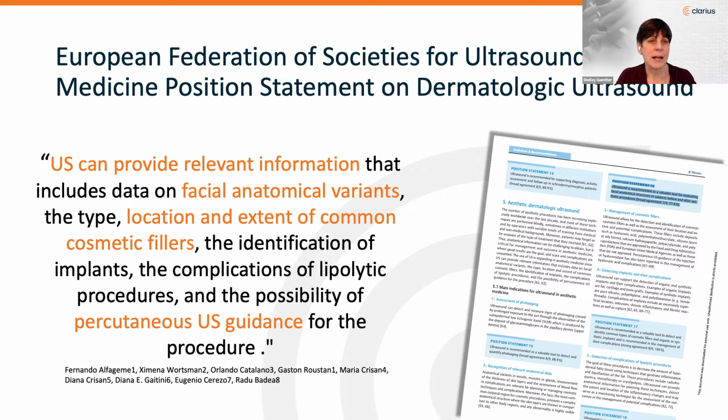And on the final slide here, there's a section dedicated specifically to aesthetic dermatologic ultrasound, which recommends, due to the dramatic increase in aesthetic procedures by operators that have varying levels of training, ultrasound is a valuable tool for evaluating facial anatomy before and after aesthetic procedures, and in the detection and identification of cosmetic fillers and implants and treatment guidance when it's indicated.